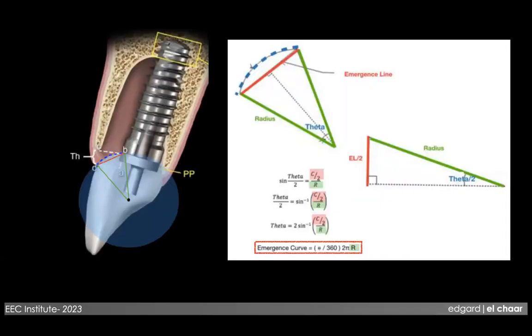And instead of doing it with our hands without any control, this technology prepared it already. And you can see here how it prepared it. This is the design, as you can see here. And that is something we did mathematically, actually, with a bunch of my former residents. And you can see that this is an arch. And we made a formula for it, and we were able to do it. So now it's publicly published. Anybody who is a computer geek can enter it.